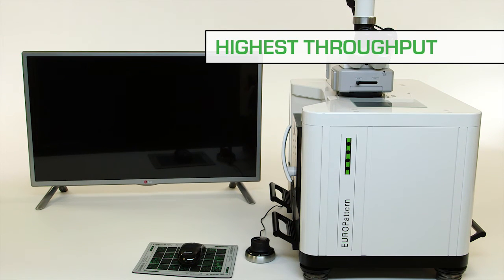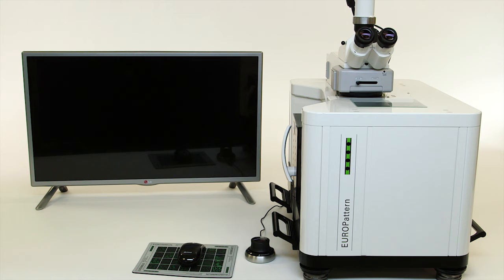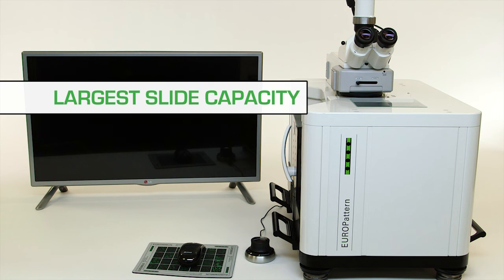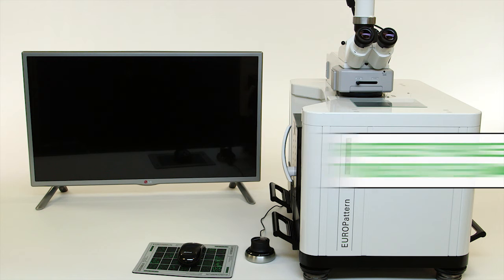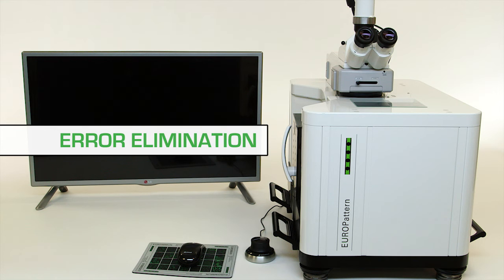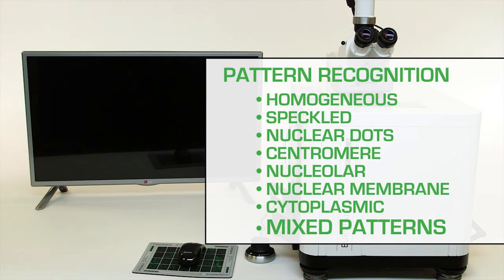The Europattern system maximizes throughput and efficiency by offering the highest slide capacity and the shortest processing time available. Errors are reduced or eliminated completely by offering the technologist automatic recognition of seven patterns including mixed patterns.